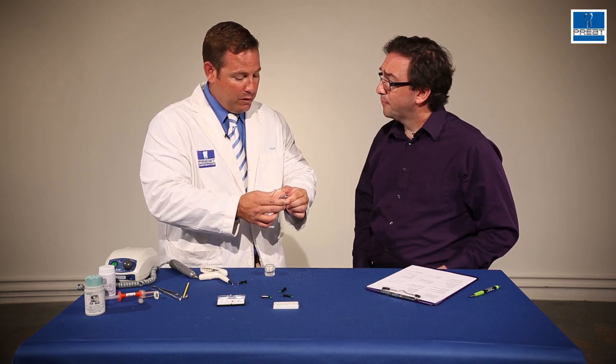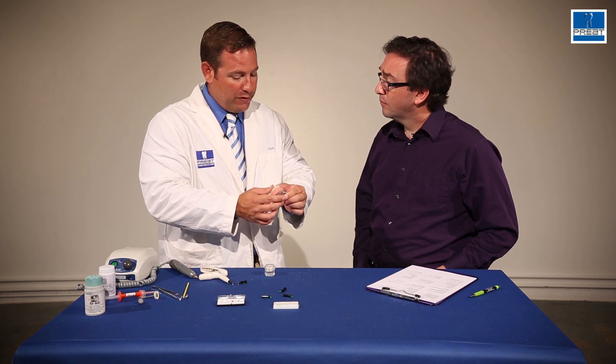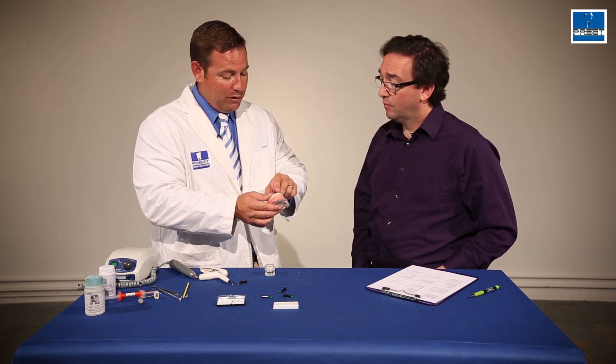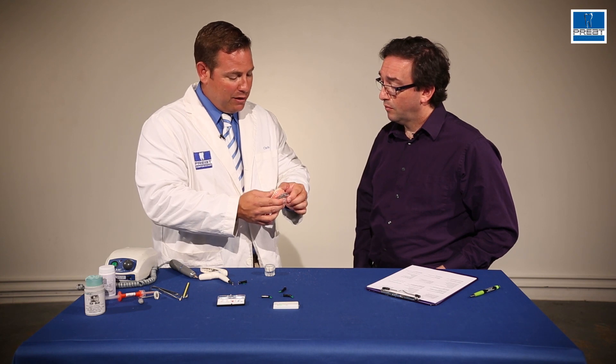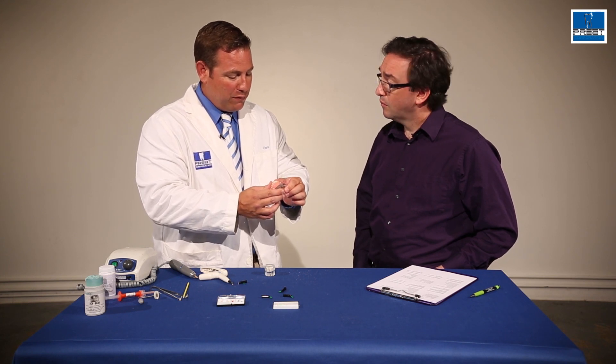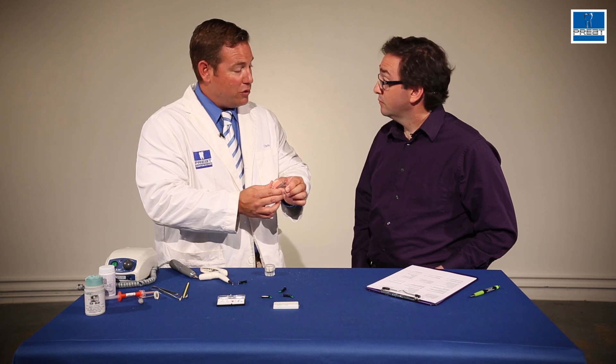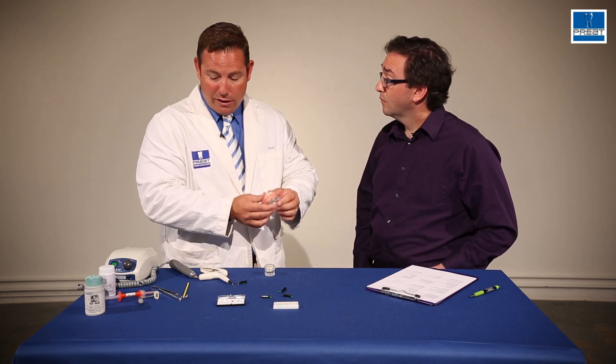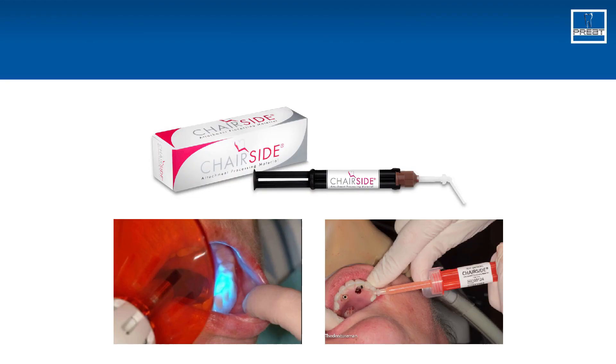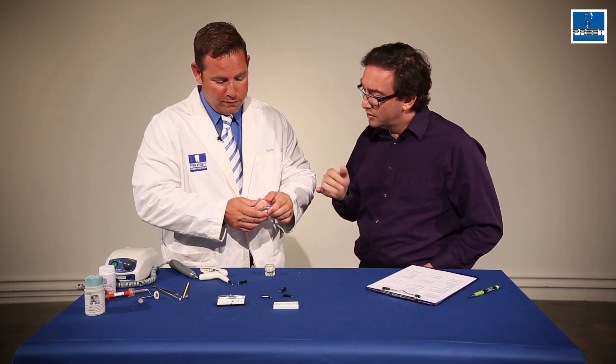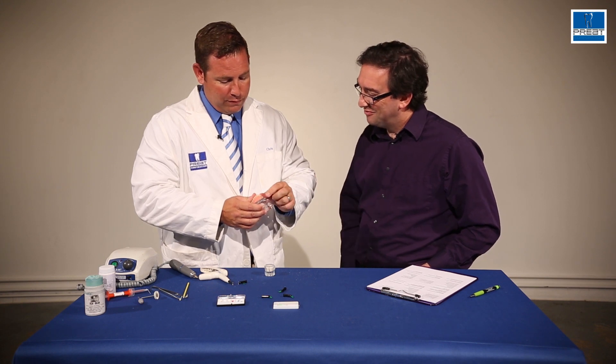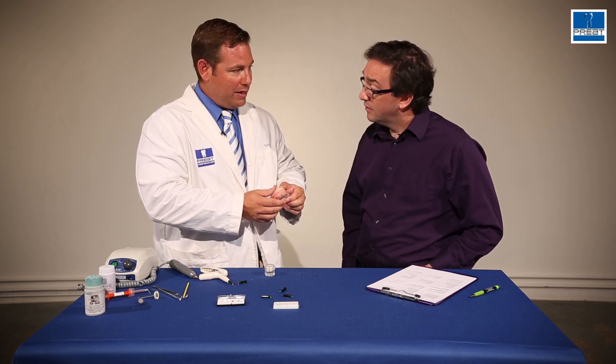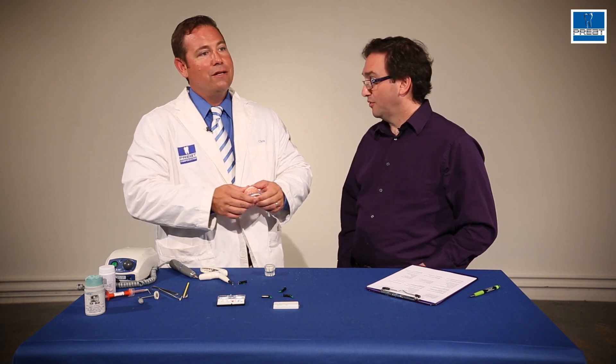About how long does it take for this to cure? You're going to want to keep finger pressure over this. You can have little cotton rolls, have the patient come in to incise over this very gently. But you're going to want to hold this here, especially if you're working with self-cure, for about seven to ten minutes. Unless you're working with a quicker set material. The other option is, you can use a chairside light-cure material that you can probably do this in three minutes. So now we're going to keep this seven to ten minutes until it sets. What do we do with the piece that's come out that front little hole? So we're just going to go ahead and let that set because we're going to polish that and remove that afterwards.